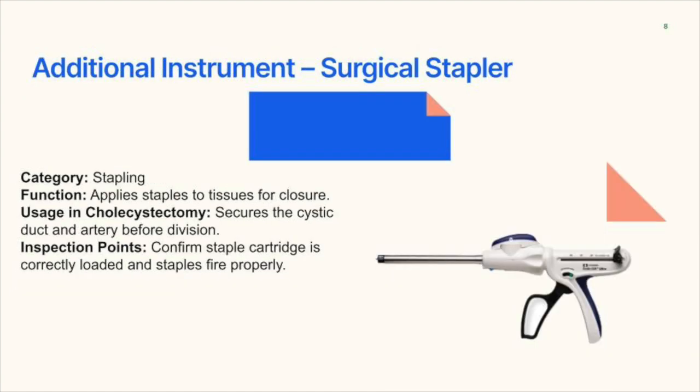And this is an additional instrument called a surgical stapler, which I do not have, but I would like to add on. Its category: stapling. Its function: applies staples to tissue for closure. Usage in cholecystectomy: secures the cystic duct and artery before division. Inspection: confirm the staple cartridge is correctly loaded and staples fire properly.